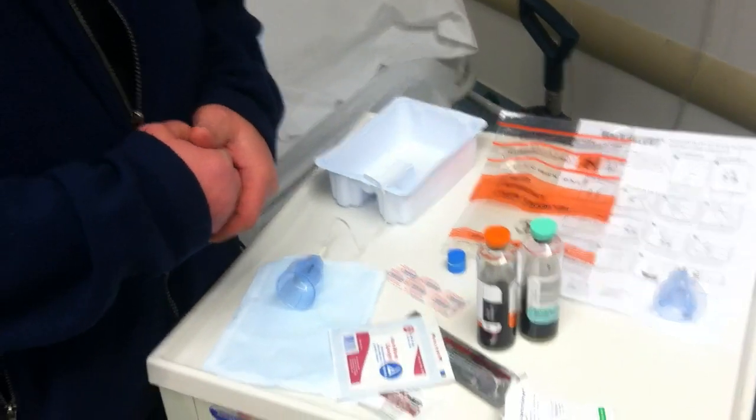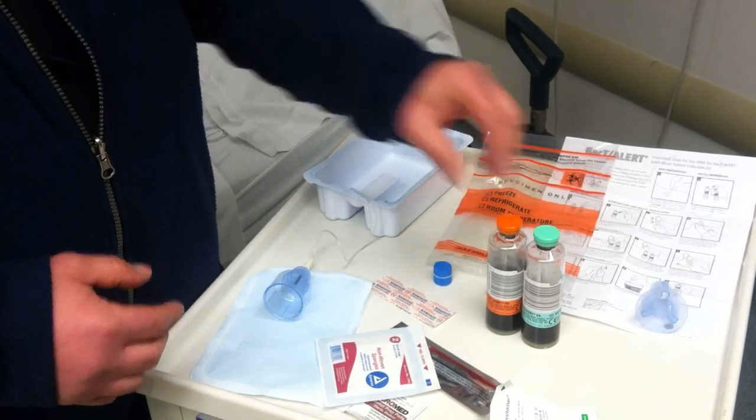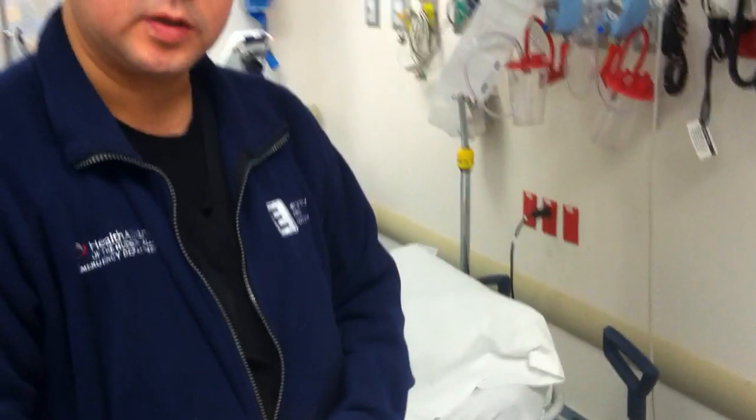Blood cultures are generally ordered times 2, and there should be a period of time between the first draw and the second draw — generally 15 minutes per collection site, and it's two different sites.